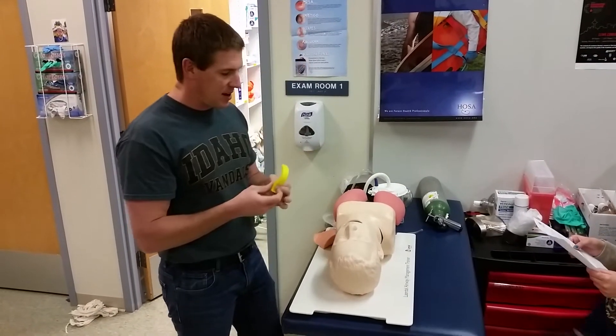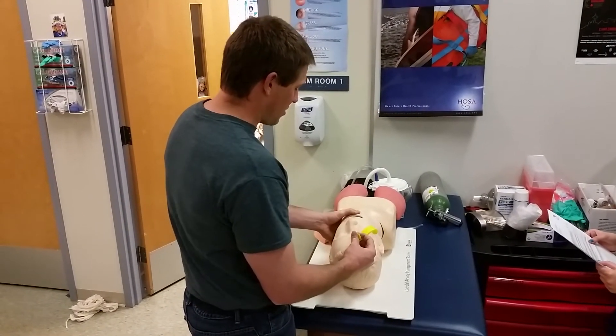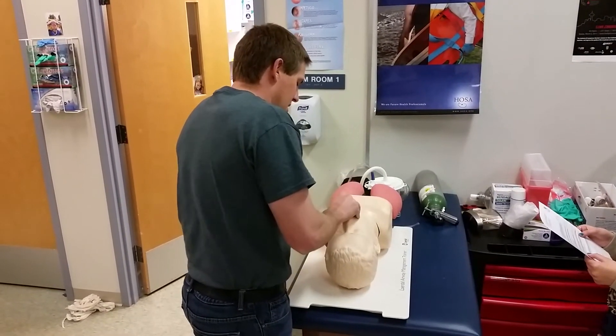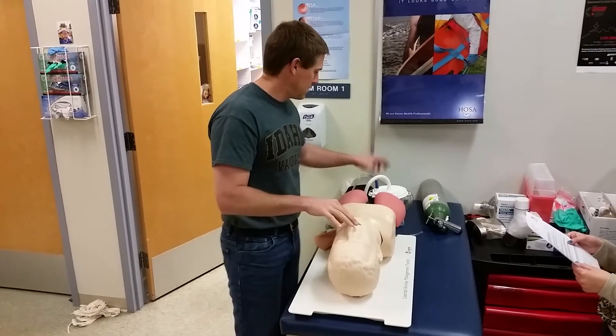The patient is unresponsive, so insert an OPA. Manually open the mouth, insert the OPA with the flange facing the roof of the mouth, rotate it 180 degrees, then push it in until the flange rests against the lips. Confirm the patient accepts the airway.